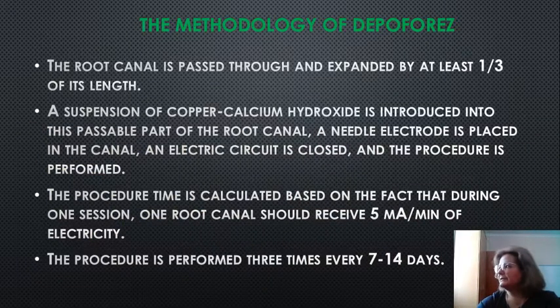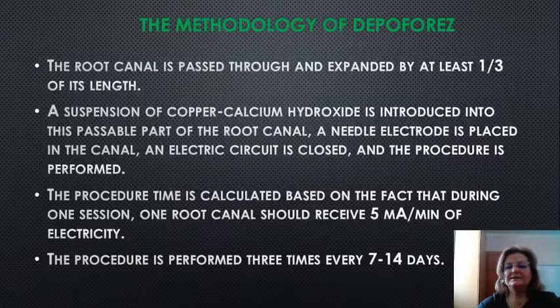The method of depophoresis. First, the root canal is passed through and expanded by at least one third of its length.